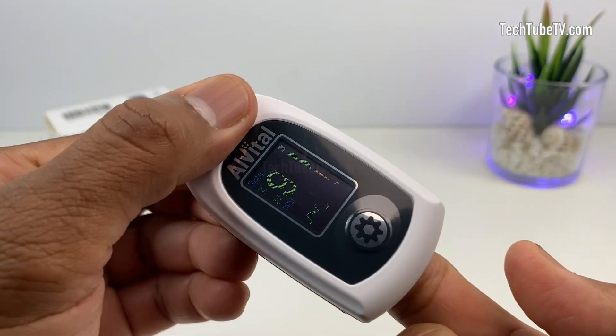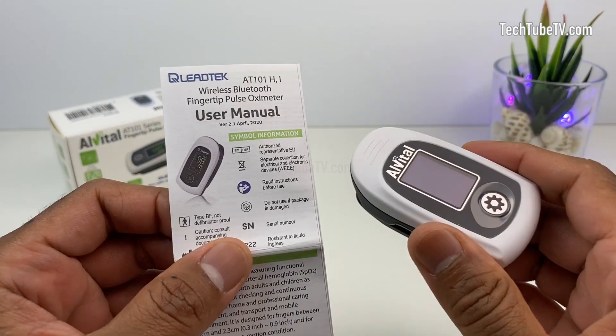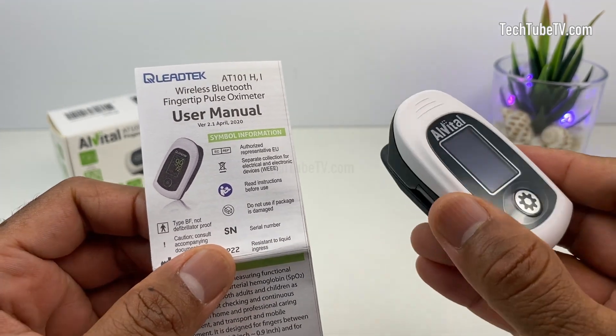When the finger is removed, the device shows 'finger out' and then automatically powers off. As indicated in the user manual, this fingertip pulse oximeter supports wireless Bluetooth connection.